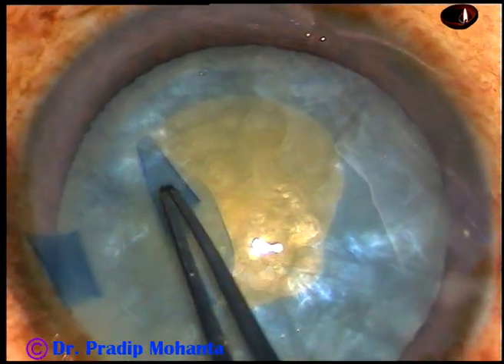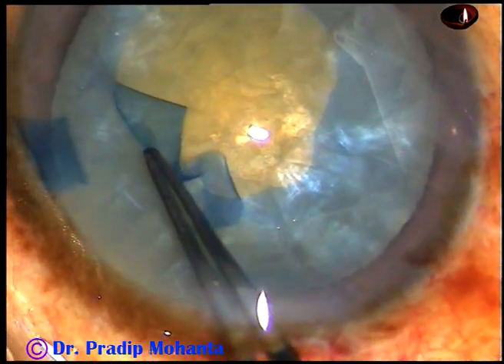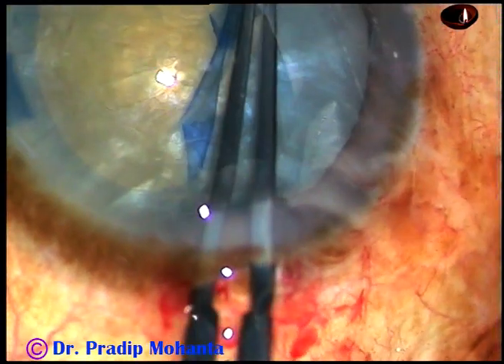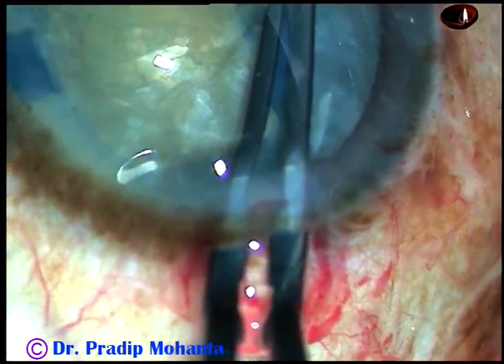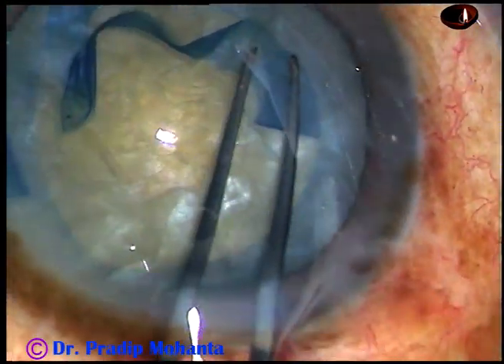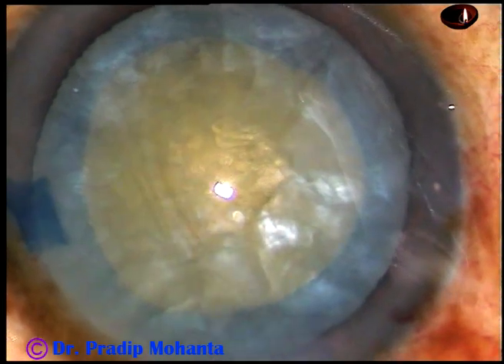I take the cystitome and enlarge this mini-rhexis into an adequate-sized rhexis. The cataract is not very hard — nuclear sclerosis is about grade 3 or grade 3 plus. And an adequate-sized rhexis of about 5.5 mm or 5.75 mm is made.